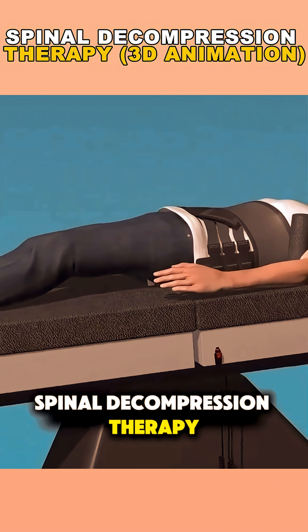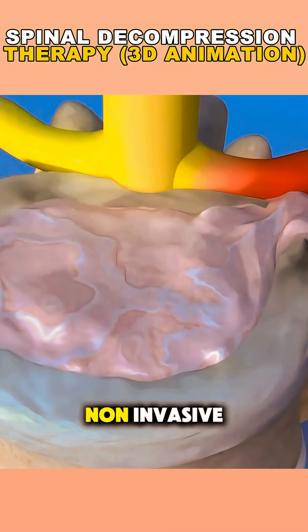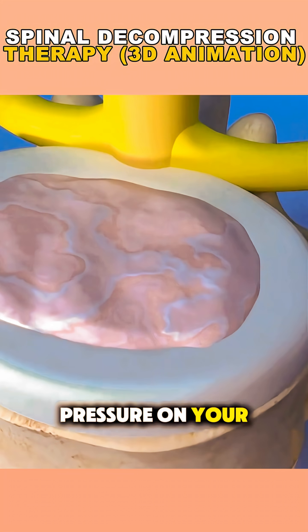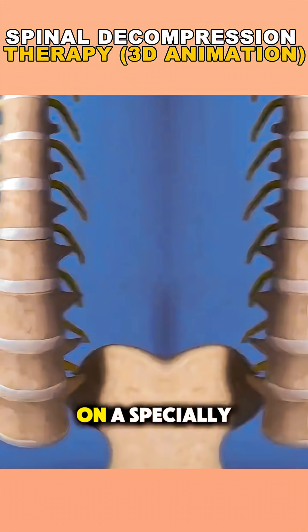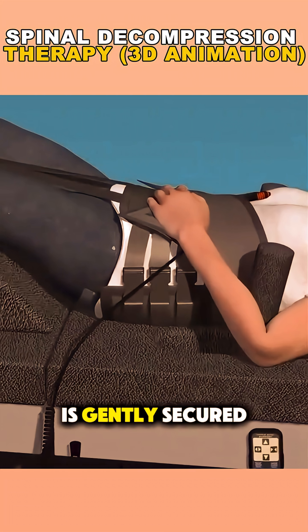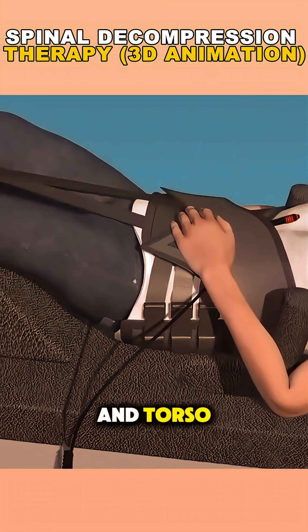Ever wondered how spinal decompression therapy is done? It's actually a non-invasive, relaxing treatment designed to relieve pressure on your spine. You'll lie down on a specially designed table, either on your back or stomach, while a harness is gently secured around your pelvis and torso.